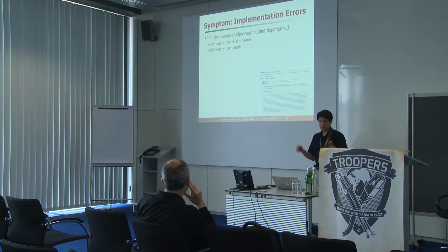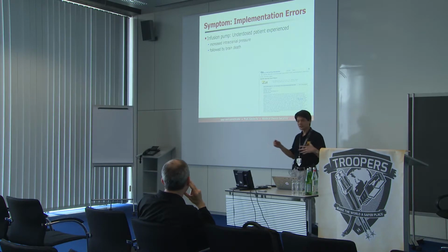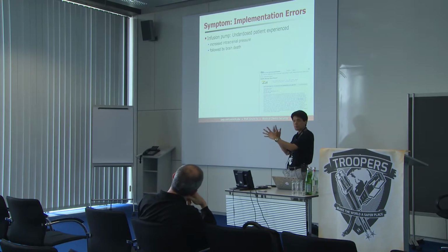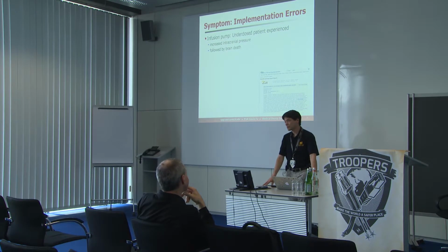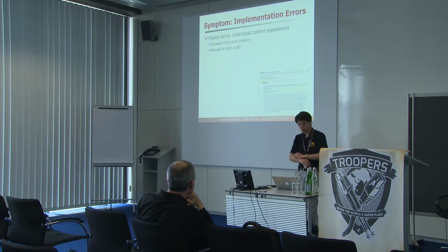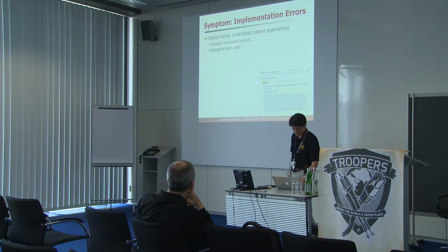What happened is this pump, so let me explain what an infusion pump is. This is a little bedside device. You'll typically see a bag of saline and a bag of other drugs, and the computer is what's mixing the cocktail of drugs that's then put through a vein into your body. So in this particular case, when the pump experienced a buffer overflow, its safety fail-safe was to turn off. So when it turned off, the drug stopped going in, but unfortunately this patient needed the drugs to live, so this caused increased intracranial pressure followed by brain death.